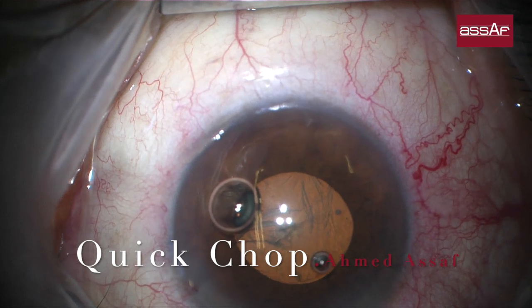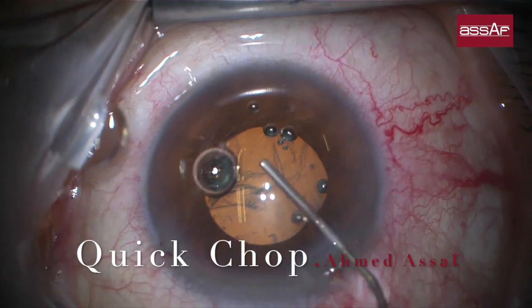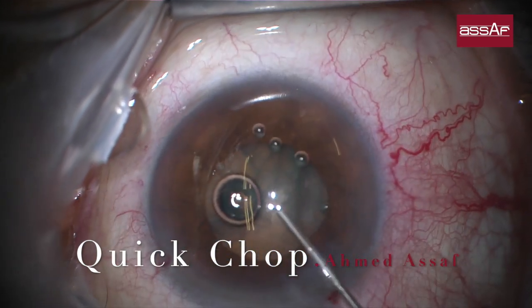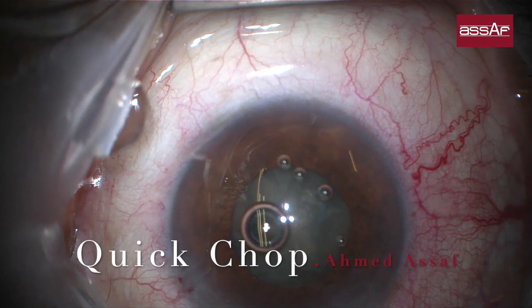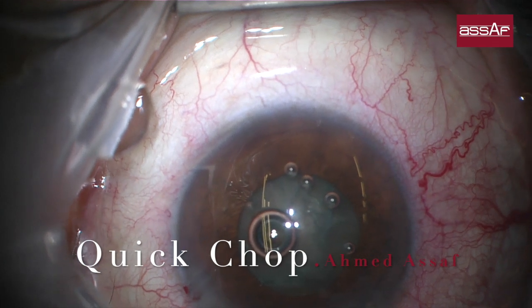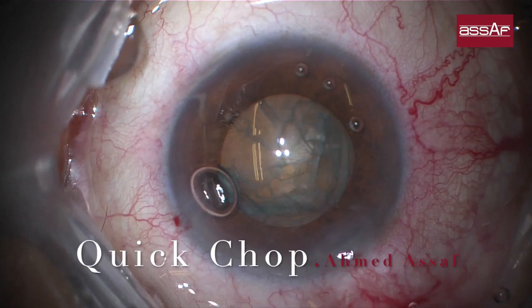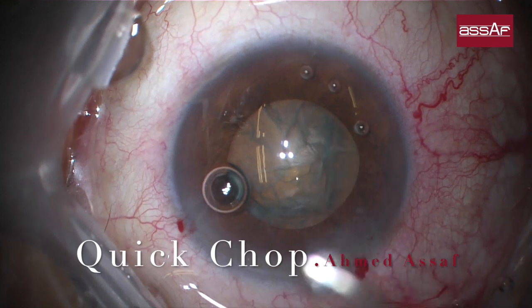The air bubble here might compromise visibility during rhexis formation and should be aspirated prior to initiation of the rhexis. Now we are ready for the next step, which is hydrodissection, followed by phacoemulsification with the quick chop technique. This is an injection of dispersive OVD to protect the corneal endothelium prior to phacoemulsification.